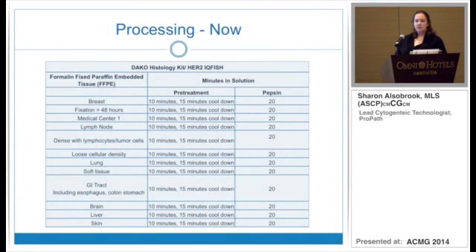Now, it doesn't matter the tissue type, breast to GI to lymph node to lung. With the histology processing kit that's included in the HER2 IQFISH and in their histology accessory kit, everything gets the same time, whether it's breast, lung, brain, everything. We can batch things together, throw them in together, same amount of time, and then just worry about which probe's going on which tissue type later.